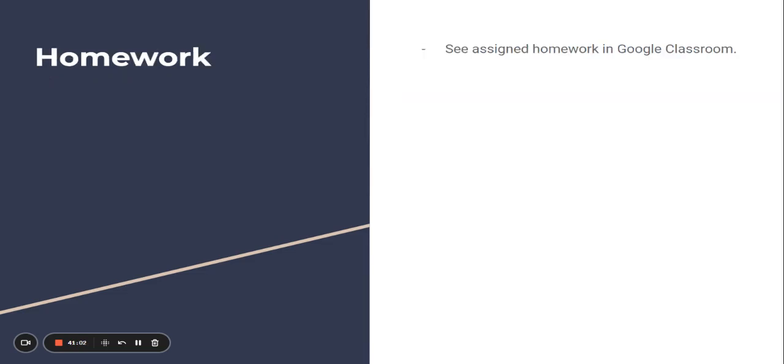So that's it for this presentation on pulse oximetry and our Tech 10 protocol. So oxygen administration. It's really important from now on to have the Tech 10 protocol memorized and understood, not just to memorize the criteria for option A or for B for COPD, A being for our diving accidents, exposure to toxic gases, respiratory insufficiency, PRU, or cardiac arrest.